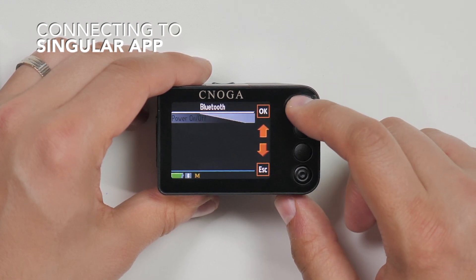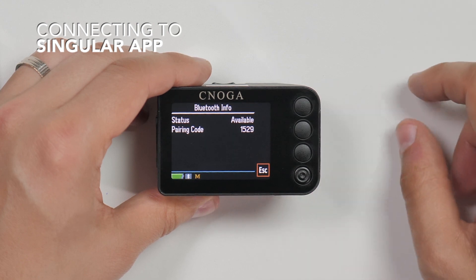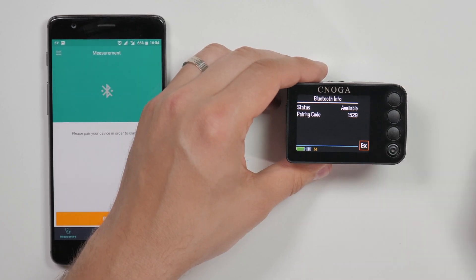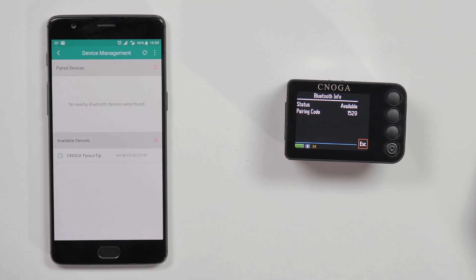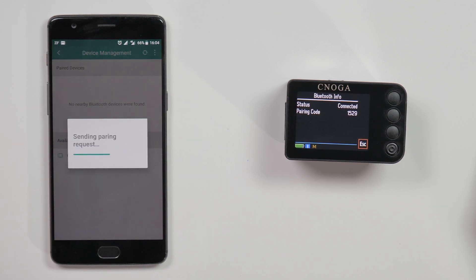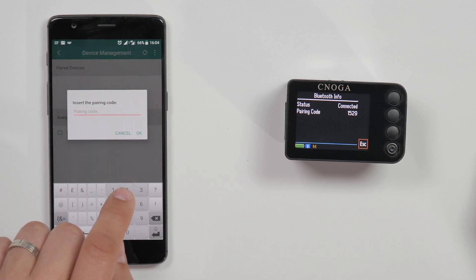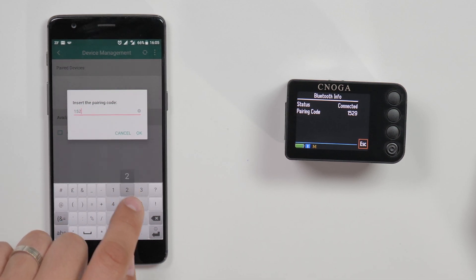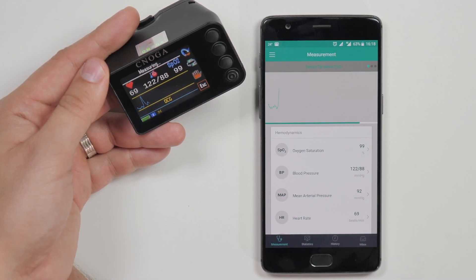Press the power on option. By choosing the Bluetooth info, you will see the pairing code of your device. Start the app, turn on Bluetooth on your cell phone, and tap pair. The app will request you to insert your pairing code. See the results in real time in the Singular app and save them to follow statistics and trends.